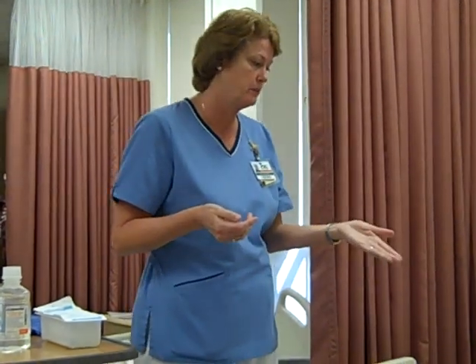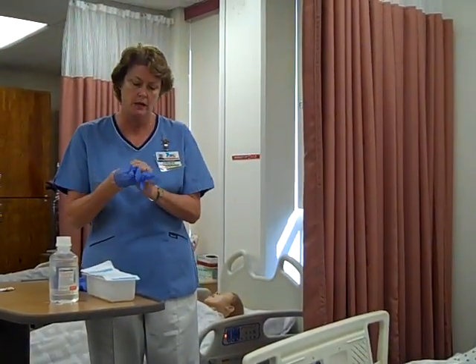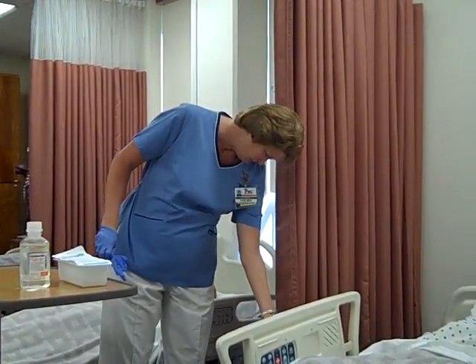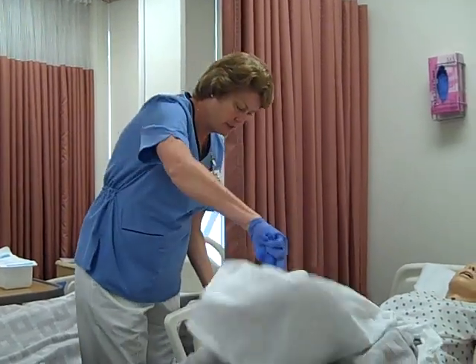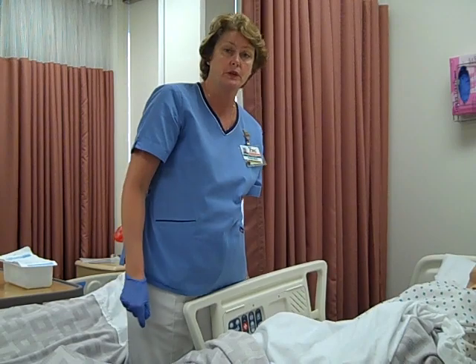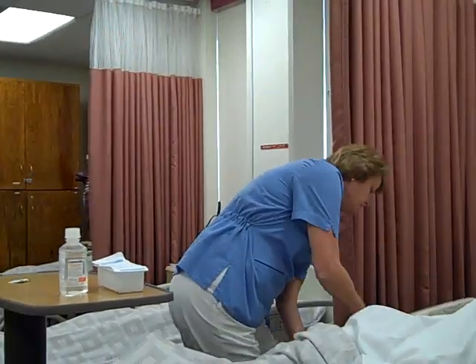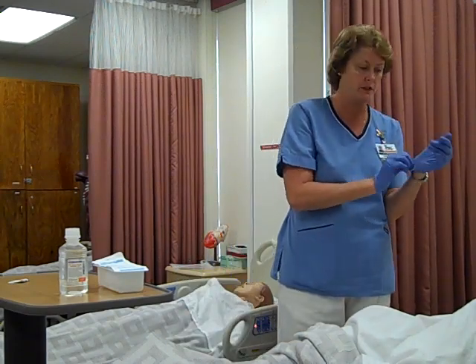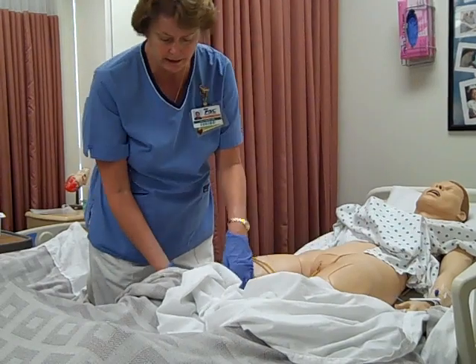We'll go into our patient's room. We're going to identify the patient and let them know what we're going to be doing. I'm going to go ahead and wash my hands and put on my gloves. We'll get the bed up to a working height. You'll want to inspect the color of the urine — you can look in the tubing here and just see what it looks like. We'll also assess the patient's bladder and see if they're distended. They feel a little distended, so that's why we're irrigating the catheter.